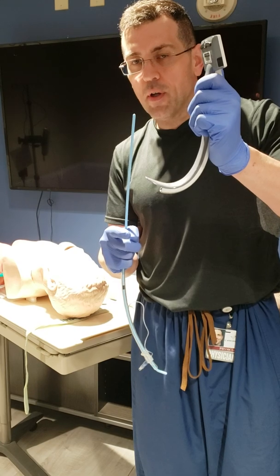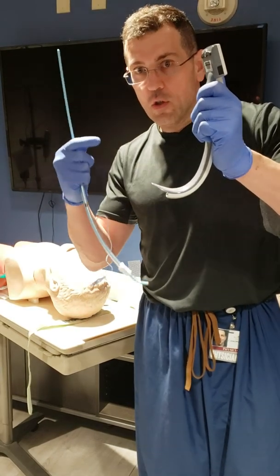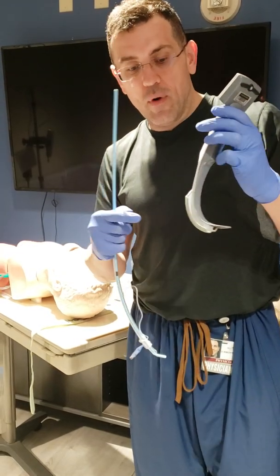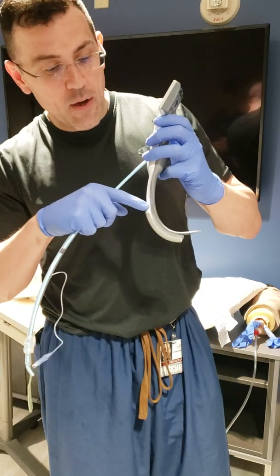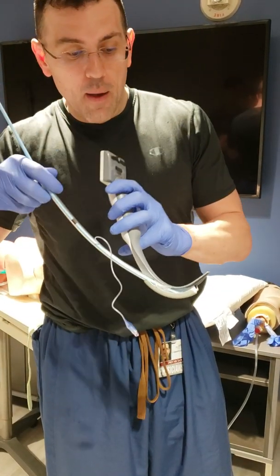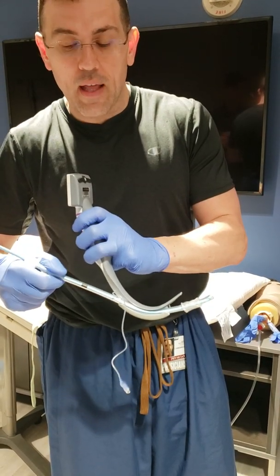That's important because with a Glidescope, you don't get direct vision and you use a rigid stylet to get in. With this particular device, since you don't have direct vision, you have a side opening where the ET tube can come down. And when it comes down, it comes out right into the glottis.